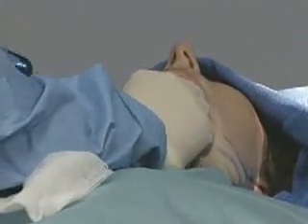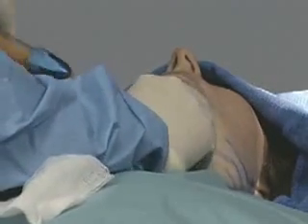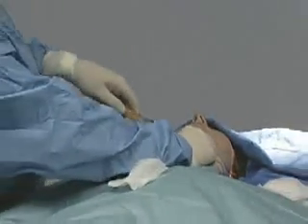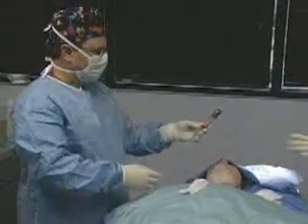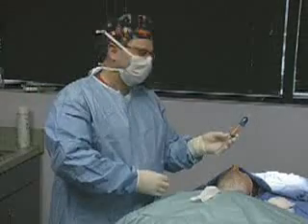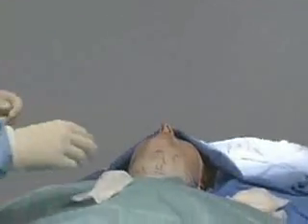And we're taking away all that extra so-called double chin with this little tube. And there you can see the chin's almost gone with just that little bit, and there's just this yellow material, and there's not a drop of blood in there at all. It's just fat and some of the liquid that we've put in. So we're going to empty that and then do some more.